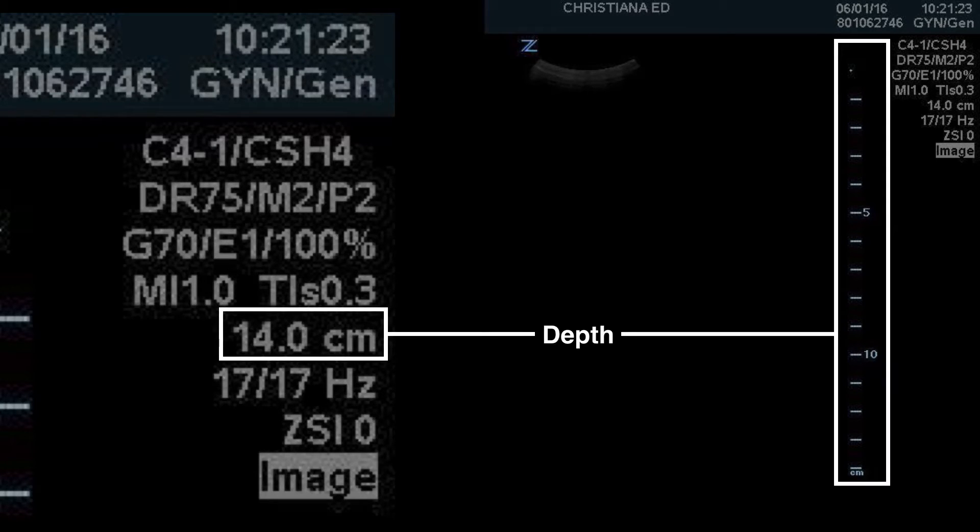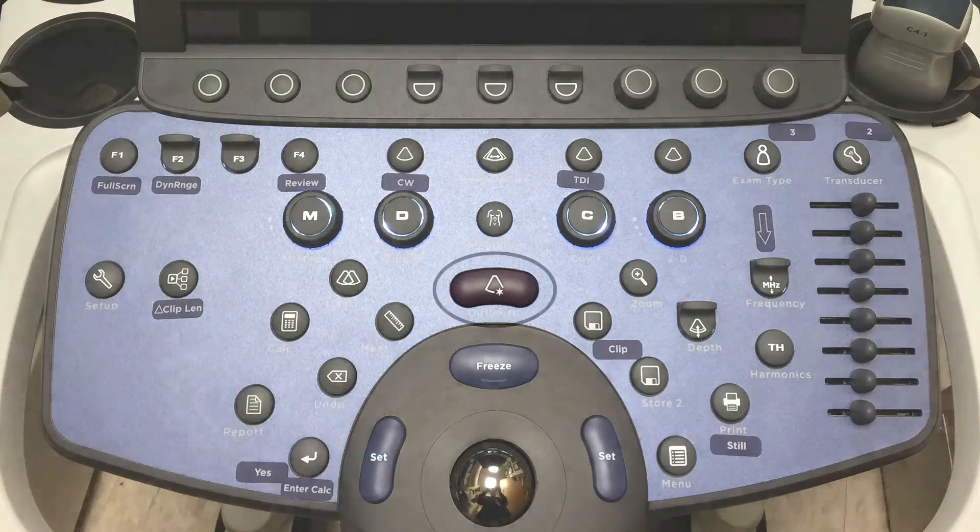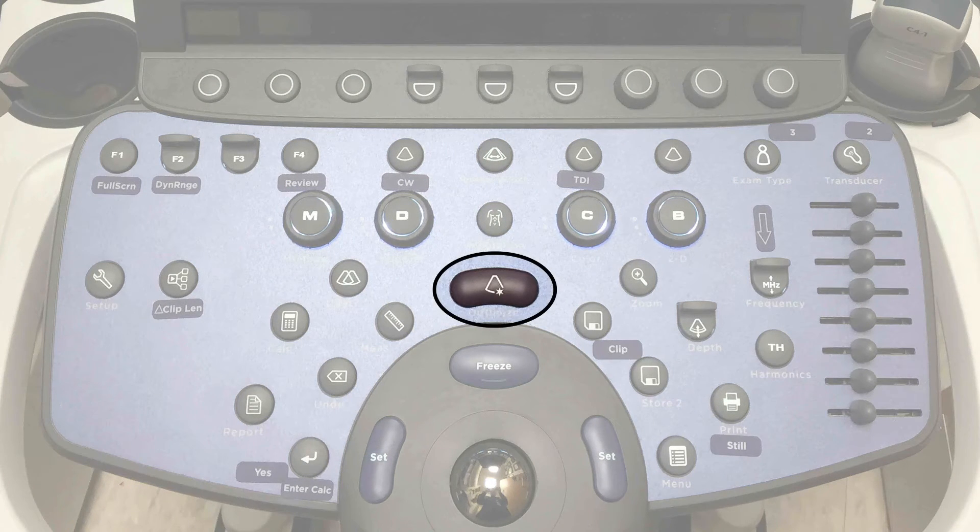You can see the tick marks all the way down to the 14-centimeter mark, with a line for each centimeter division. To optimize gain, we have the optimize button — the little star highlighted in red. When you press that button it tries to optimize your gain settings. It may not always be perfect, but it gets you close.